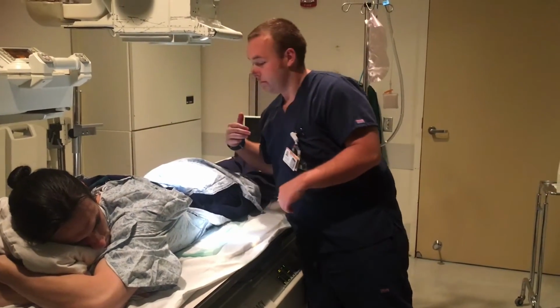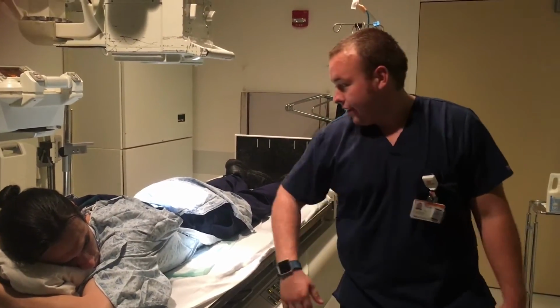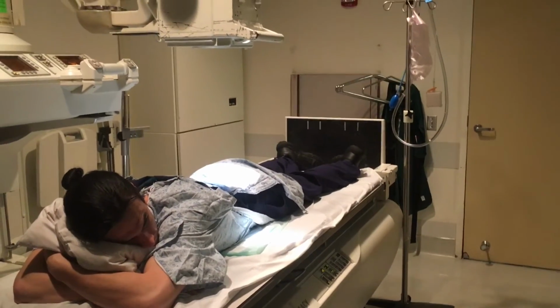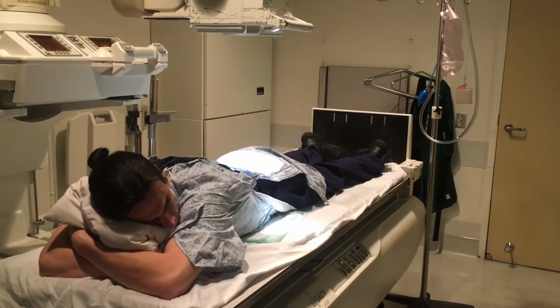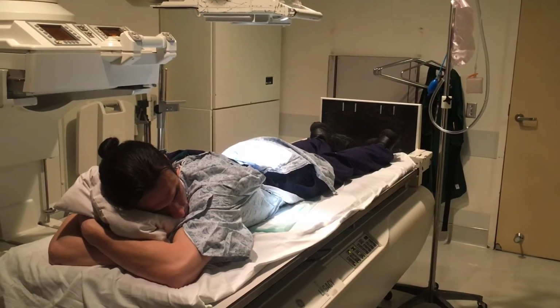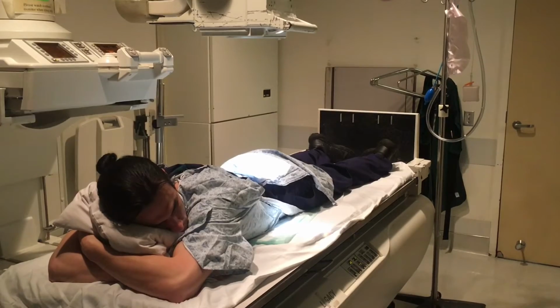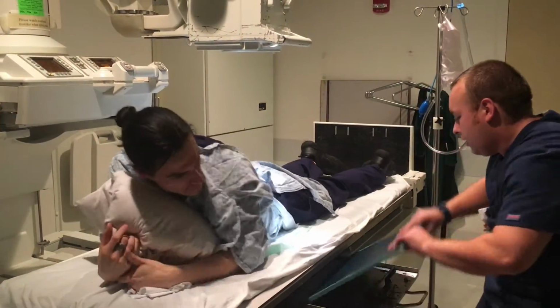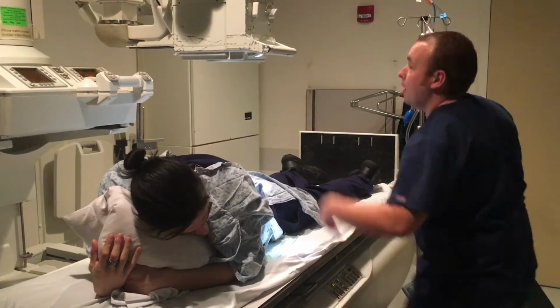Alright. Techniques at 85 at 40. Taking a deep breath. Blow out. Hold. X-ray. Breathe. Alright, so let me just make sure this image came out and I got what I need. I'll be right back.